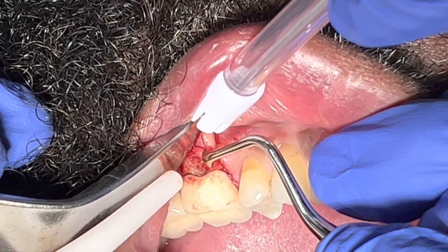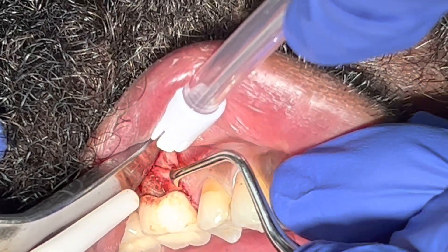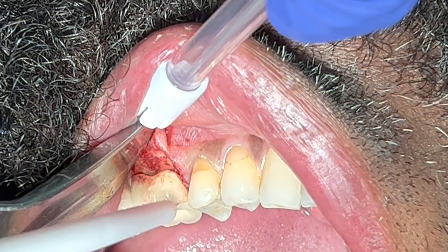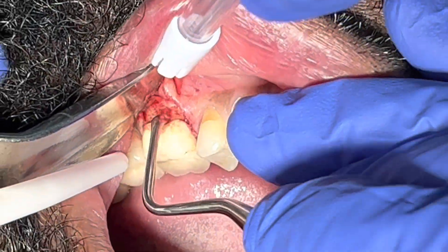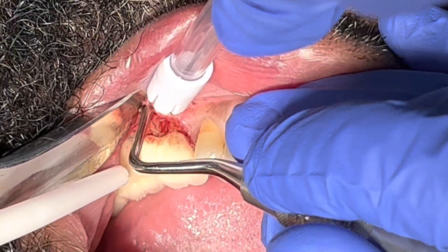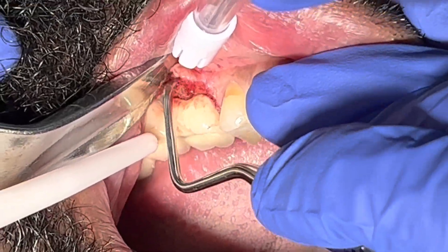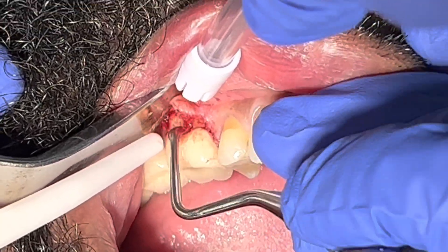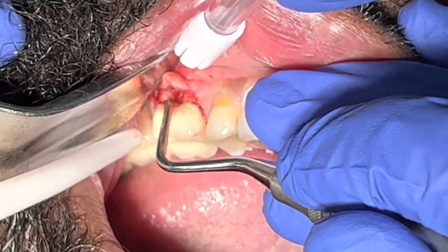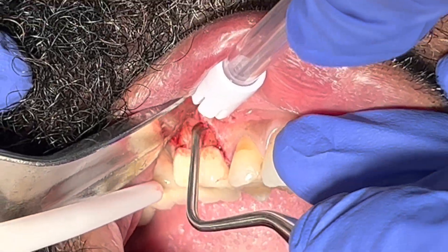Right now I'm using the curette to level down the rough edge of the buccal area where the furcation bone defect is, which has been allowing bacteria to invade that furcation area. I'm continuing to release — starting from the distal aspect of number 19 and moving mesially, trying to be minimally invasive as possible.